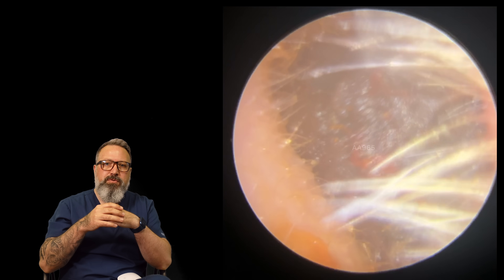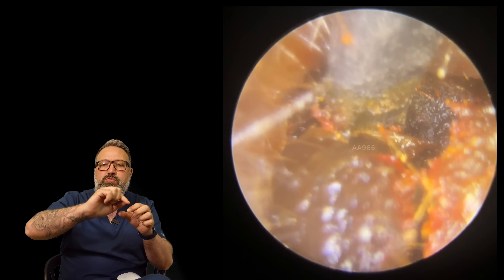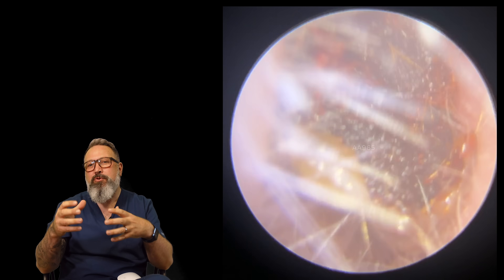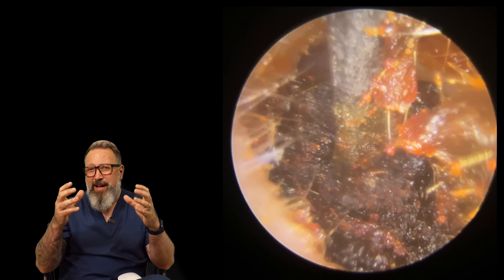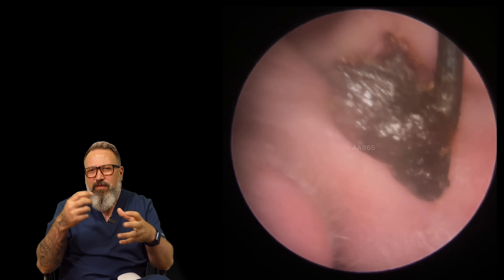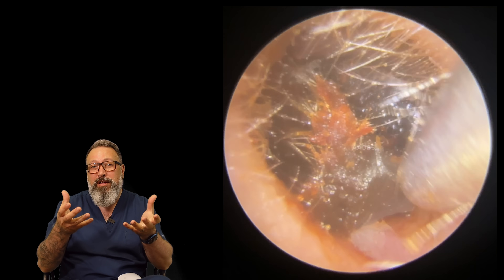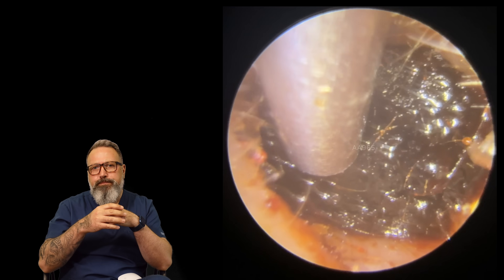Because this is a very sticky, soft type of ear wax, I've opted for a Jobson horn - a curettage tool with a ring at the end, available in oval or round. I prefer oval. Look at the color of this wax - almost ebony, bordering on a cherry red with red flecks in the dark wax. I've introduced a little olive oil to help lift it off the canal wall so it doesn't re-stick, and I'm working around the outer edges into the central portion for a better grip.